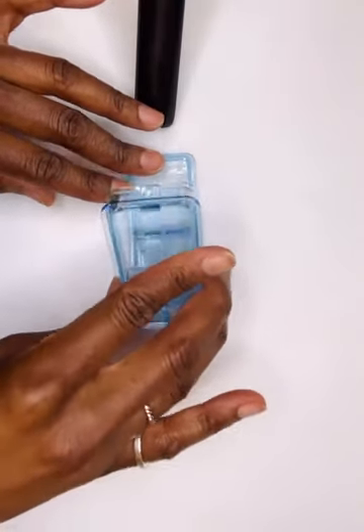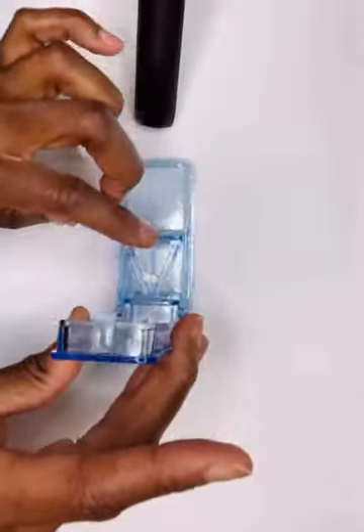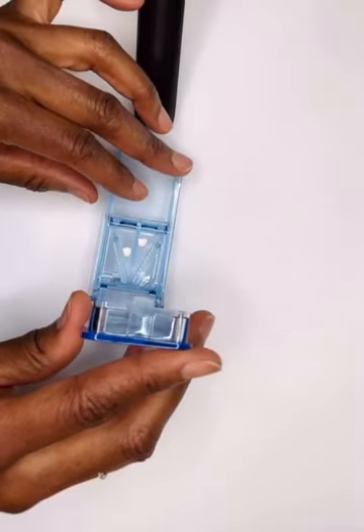What you do is you bring the blade down and you close it just like that. You hear that click. And as you open it up, there you go. You see the pill is in 2 pieces. This is basically how you cut a pill in half. The pill that I put in, it was the smaller one. I put it in the scored side up. When I say scored, that is that little line right there. You want to have that up so that the blade goes right down that score and helps to cut the pill in half. That's super important.